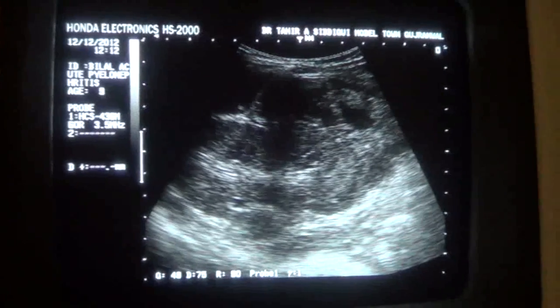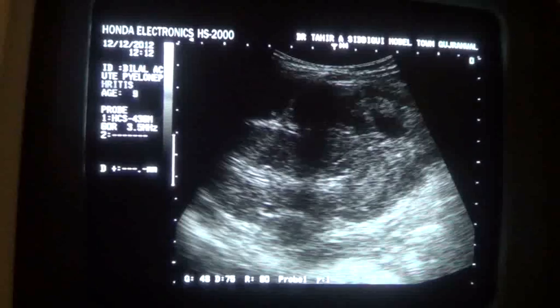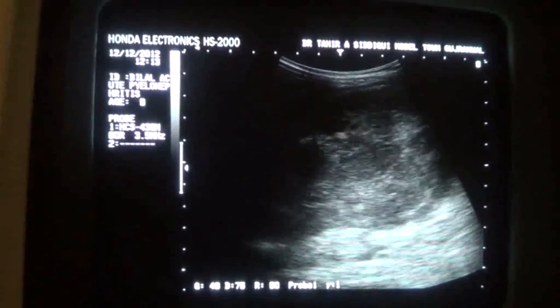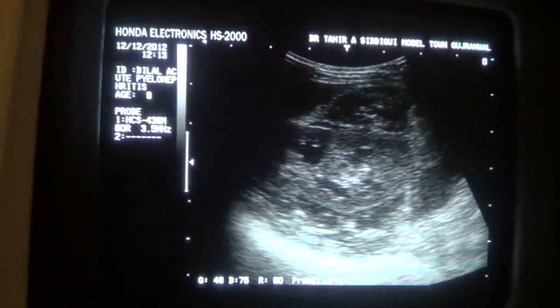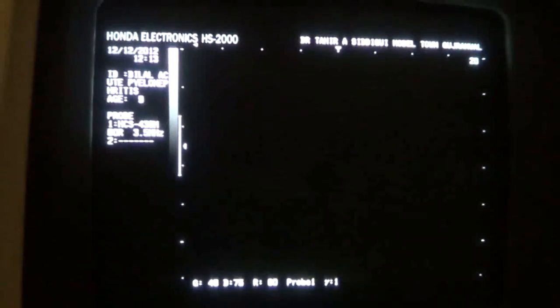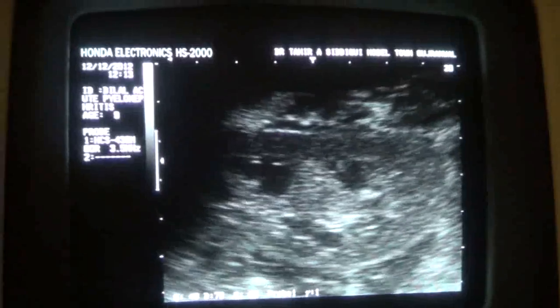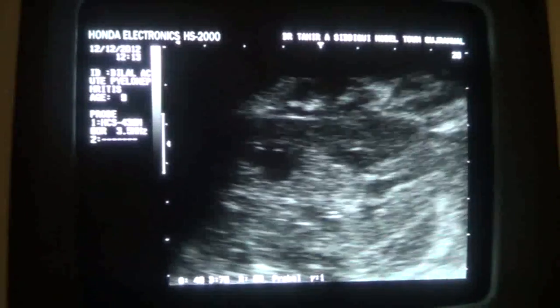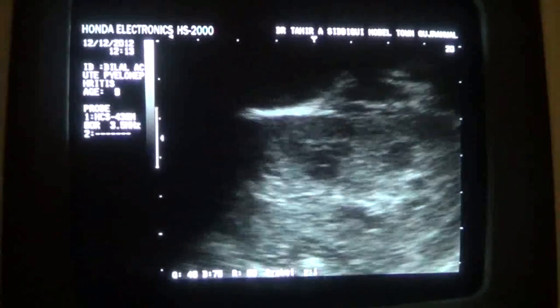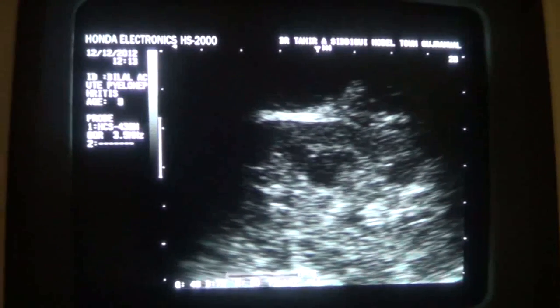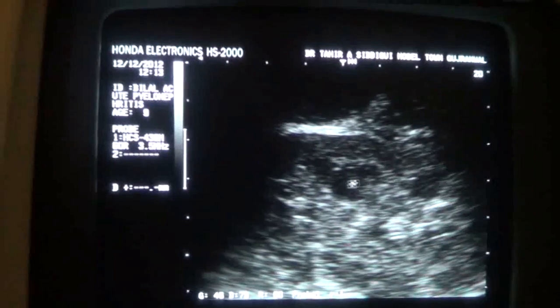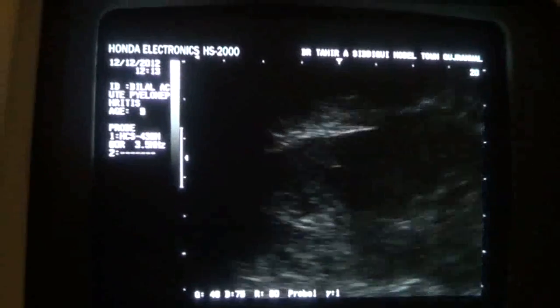This is the cortex and this is the medulla. Now in the prone posture, you can still see the pyramids stand out very prominently. There is a slight obscuring of the central sinus echo complex. The pyramids have echoes within them at all levels.